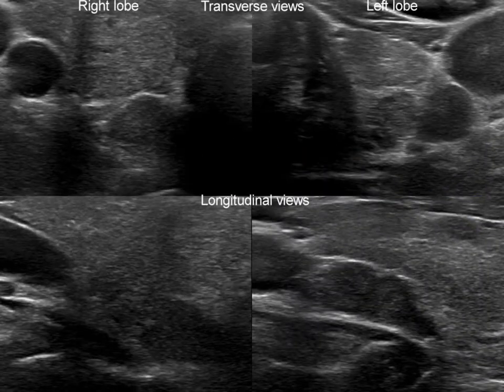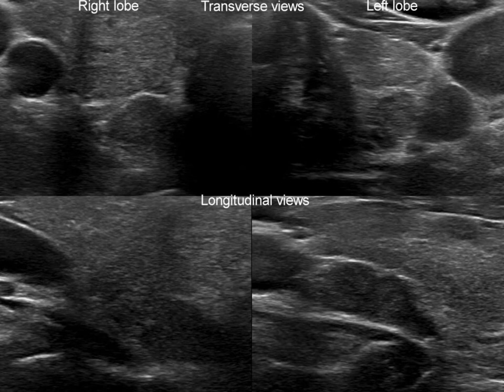It is worth comparing the two hypoechoic lesions. The right one proved to be a thyroid nodule, while the left one proved to be a parathyroid adenoma.